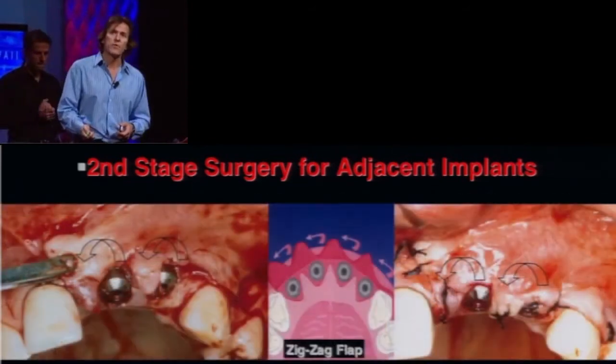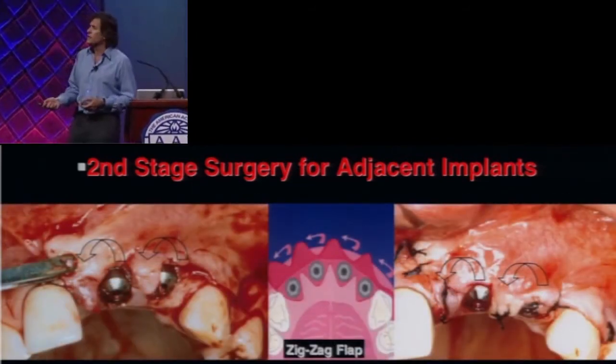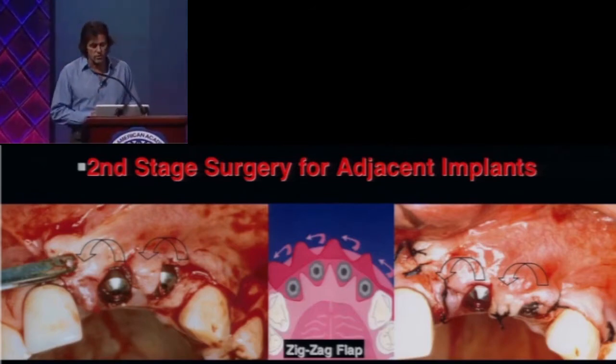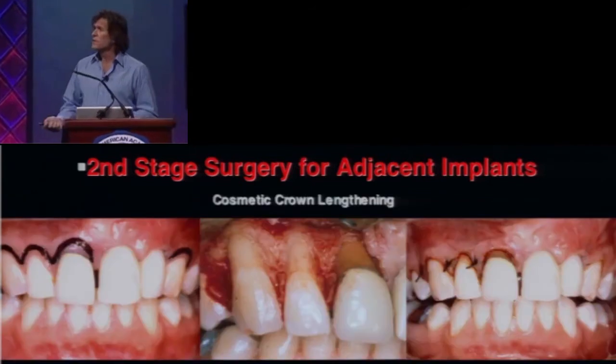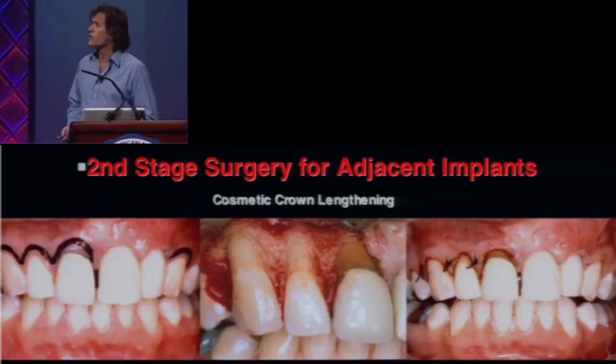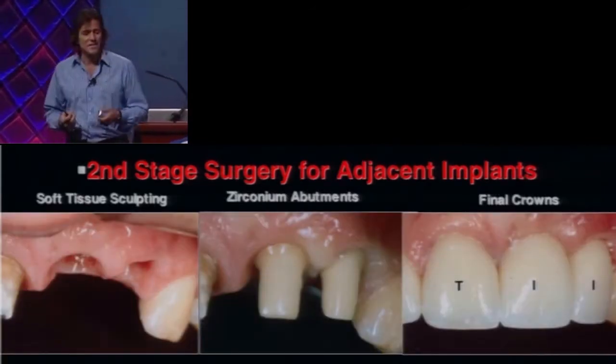And that's exactly what you're seeing here. So we don't lose or remove that tissue. We actually enhance it, overlap that interproximal area to gain additional vertical height. We use crown lengthening procedure on the adjacent side to level off the gingival margins, zirconium abutments, and then really trying to get the best aesthetic result.